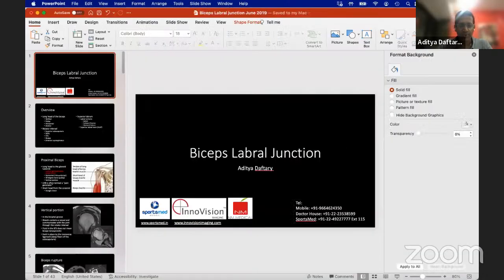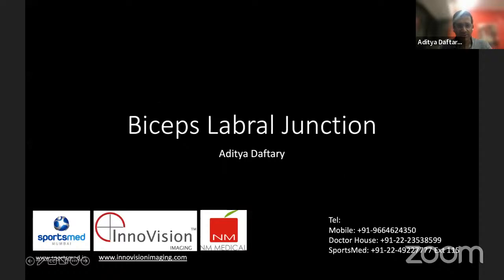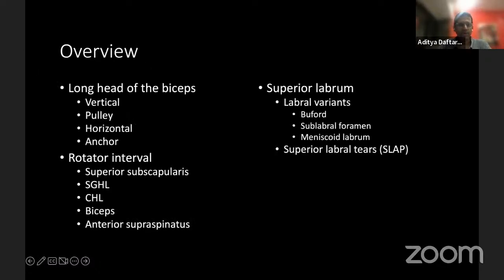Now we'll talk about the biceps labral junction. We'll cover the long head of the biceps — its vertical portion, the pulley, the horizontal portion, and the anchor. Then we'll talk about the rotator interval structures: the superior subscapularis, superior glenohumeral ligament, coracohumeral ligament, biceps, and anterior supraspinatus. And then we'll talk about the superior labrum, its labral variants, and the SLAP lesions.